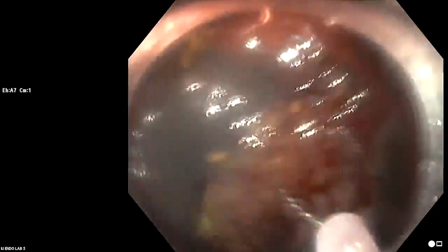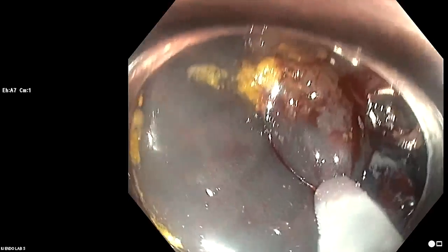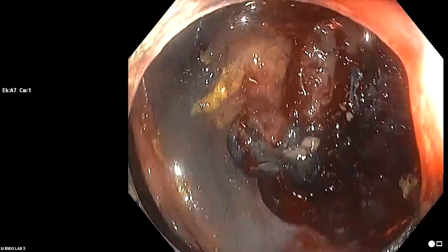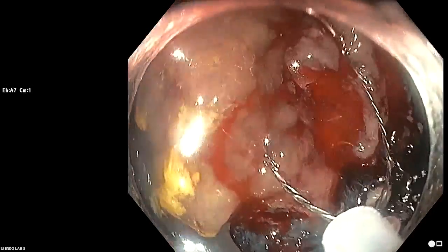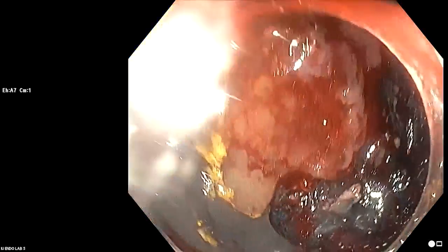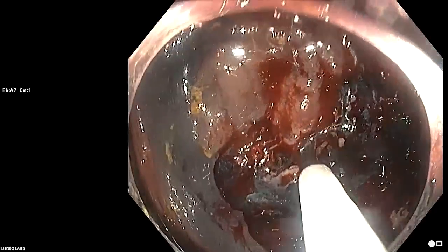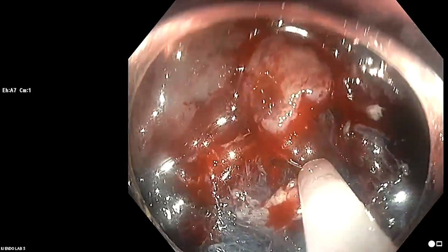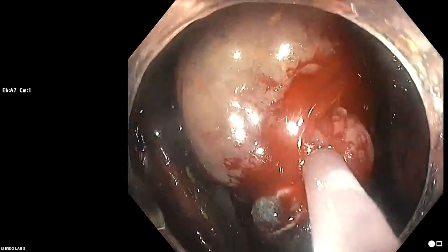But obviously we don't have to do that if we are resecting cold. So at some point, I'm sure we'll talk about whether there's a set of adenomas that can be removed without electric cautery. But we'll actually save time doing this cold because we don't have to clip. We don't burn up the edges. Some people, I'm sure somebody's going to do a study of electric cautery to the margin of large lesions that are removed cold and see if that helps reduce the recurrence rate. But there's good reason to think it won't be as effective.